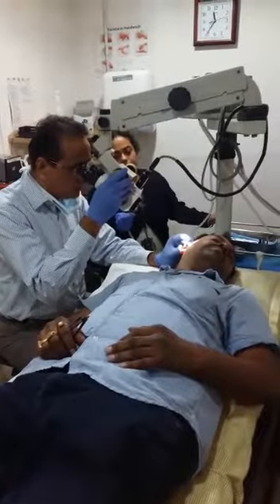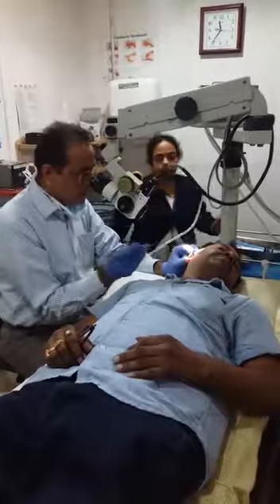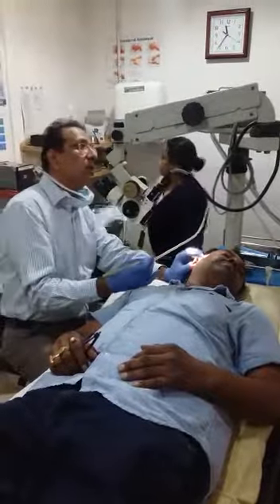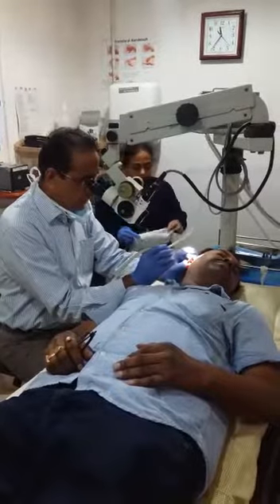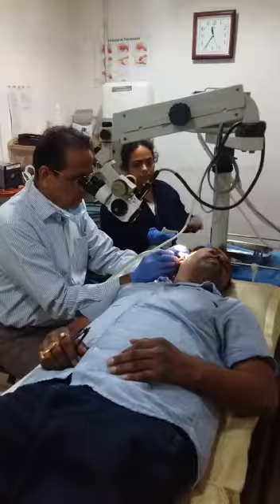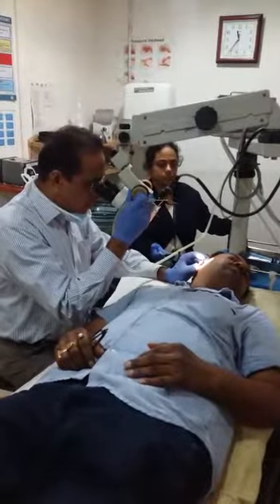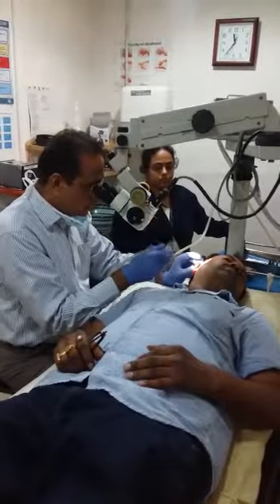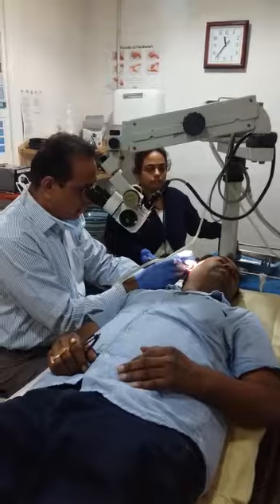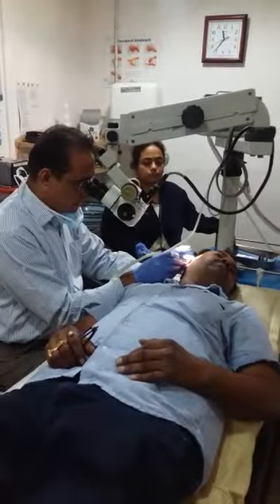The examination of the right ear in the OPD. We are using the microscope and cleaning the ear of this patient under microscope. This is routinely done in our OPD, where we examine the patient and clean the patient's ear using the microscope.